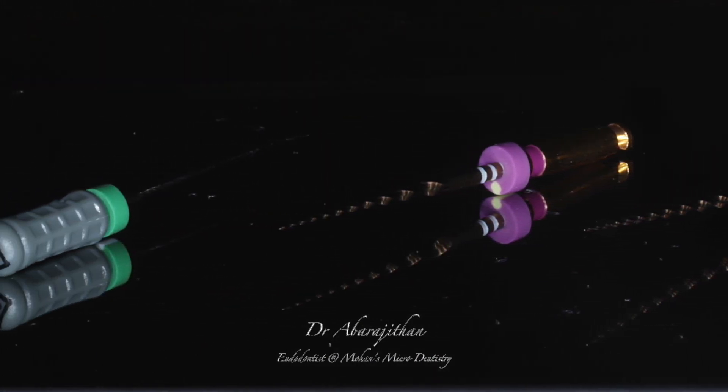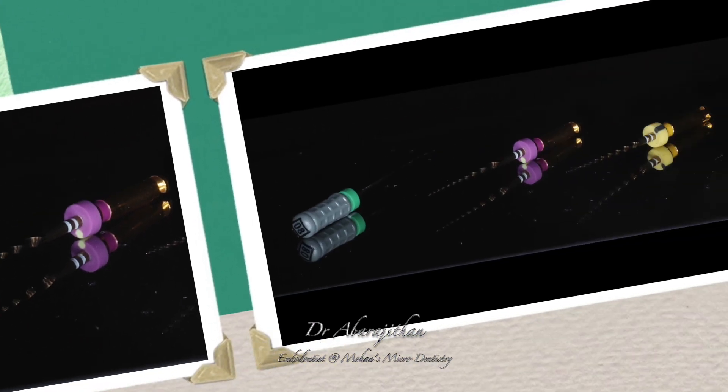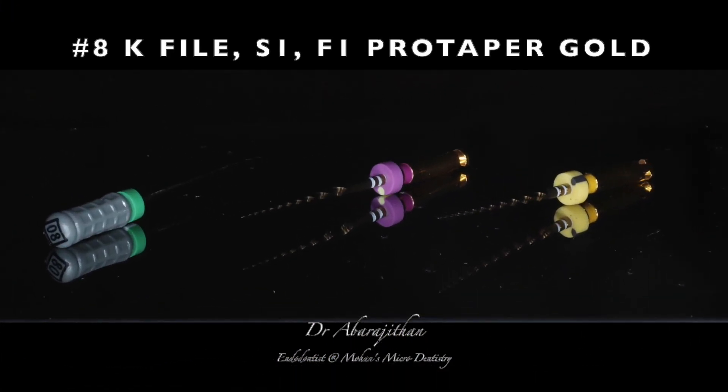We have three files: an S1 Protaper Gold, an F1 Protaper Gold, and an 8 size K file.